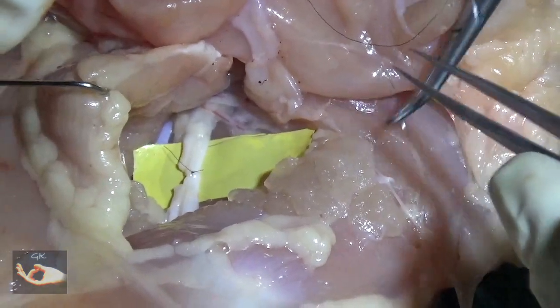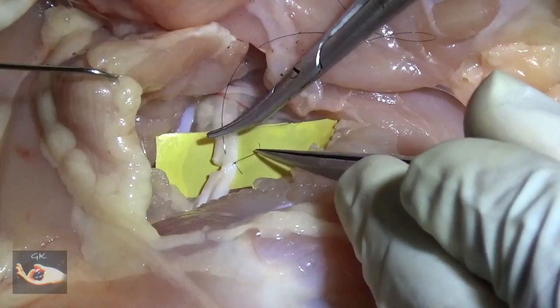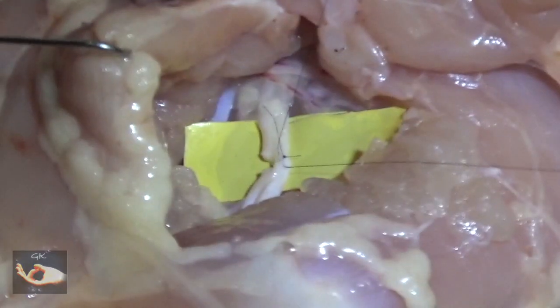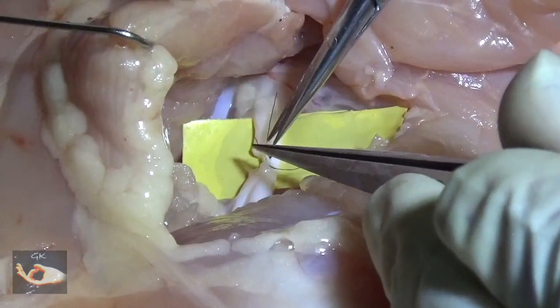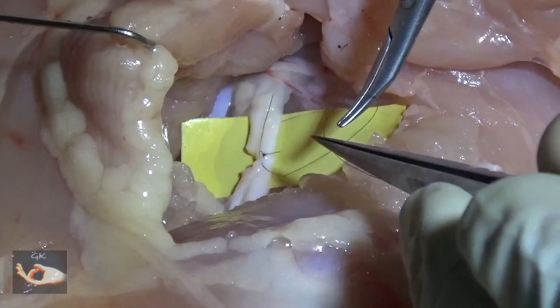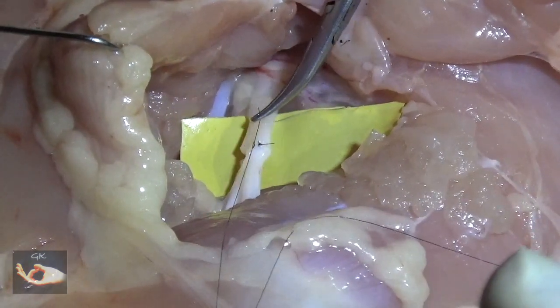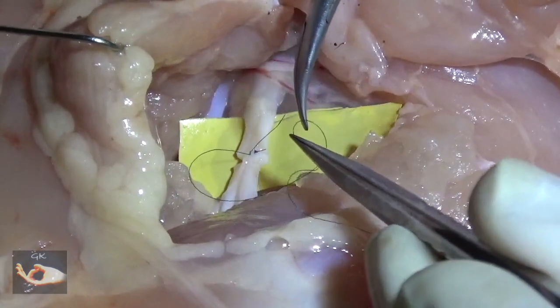Now we prepare for the second suture that is going to be applied. Using the previously cut suture as a traction suture, the next epineural stitch can be taken, coming out through the cut end. Before tying the knot, the excess length of the traction suture can be cut, and then the knot is tied on the second bite taken in the epineurium, making sure to retain the same tension as was applied for the first suture.